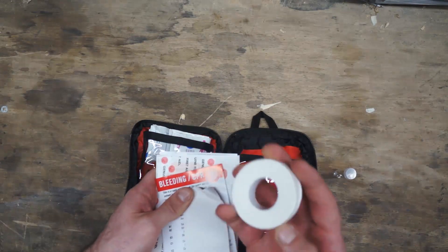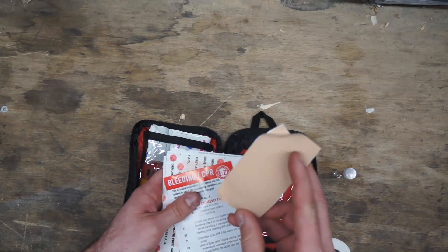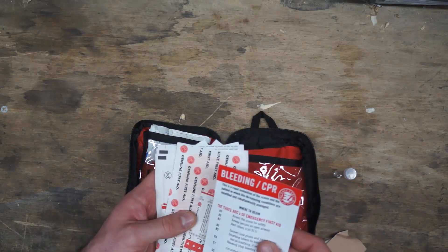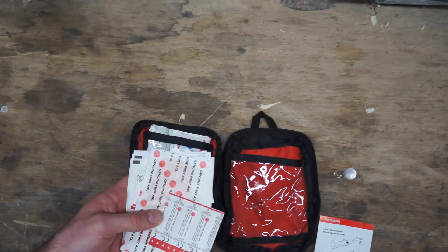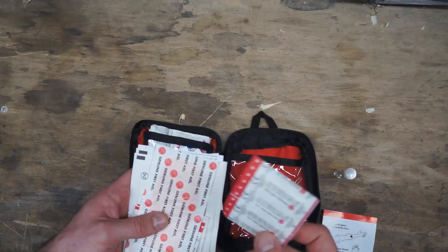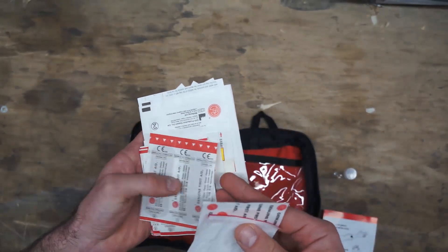Next up there's some medical tape — a fairly small, thin roll, but it will work in a pinch. A little bit of moleskin, fairly small but enough to get you by for the afternoon. There are also bleeding and CPR instructions, though most people are never going to read those, and frankly if you're waiting until you need it to read it, you're probably waiting too long.